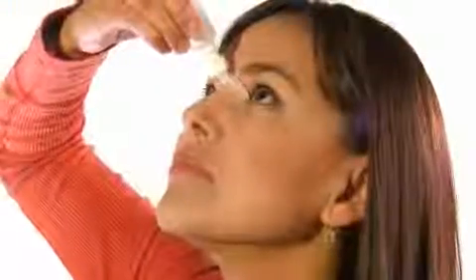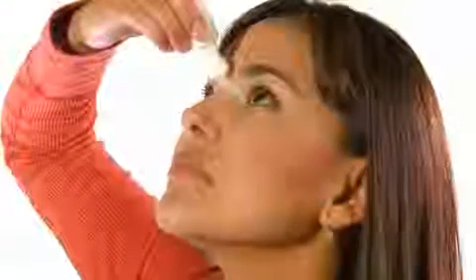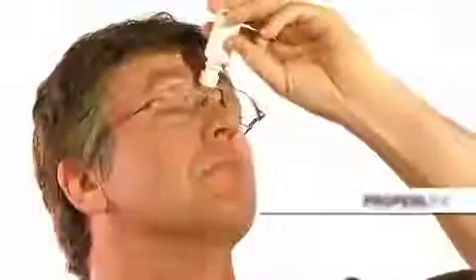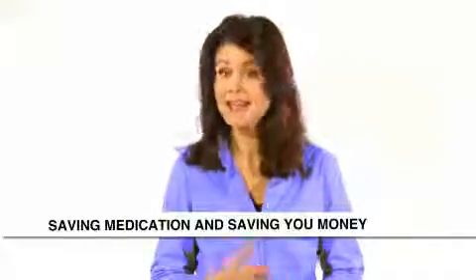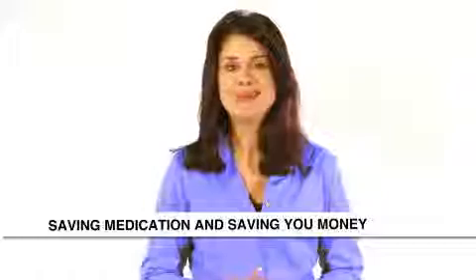Then rest the flexible arched applicator on the bridge of your nose, allowing the tip to touch the corner of your eye. Gently squeeze the bottle until you feel a drop in the corner of your eye. The advantage of the Crest Dropper is that you can feel the applicator on the bridge of your nose, and you can feel the drops as they gently and comfortably glide into the inner corner of your eye — providing stability and assurance that the drops go in your eyes and not on your face, making the treatment more effective.